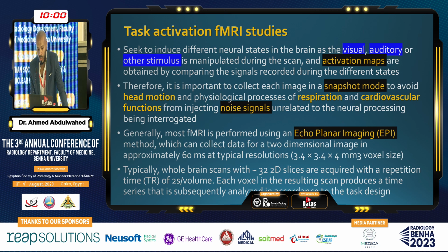We seek to induce different neuronal states in the brain, like visual, auditory, or any other stimuli. And this is manipulated during the scan. We then generate activation maps obtained by comparing the signal recorded during different states.